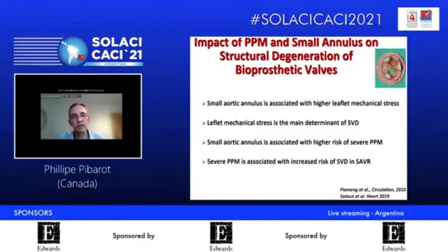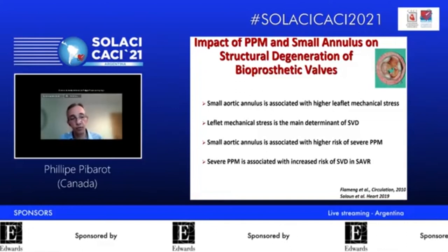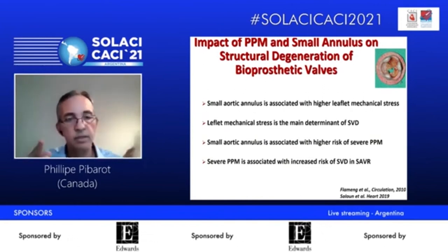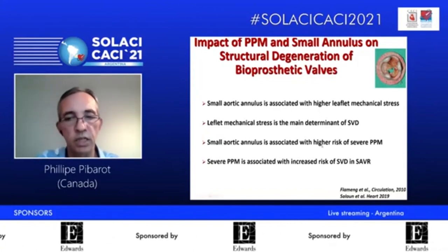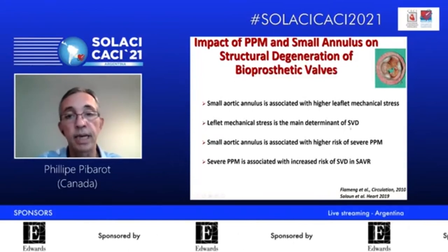And leaflet mechanical stress is the main determinant of structural valve deterioration of bioprosthetic valves. This has been very well shown in SAVR series. Furthermore, a smaller aortic annulus, as we showed, is associated with a higher risk of severe mismatch. In turn, several studies have shown that severe mismatch and residual gradient are associated with increased risk of SVD following SAVR. So it's a double trouble here.